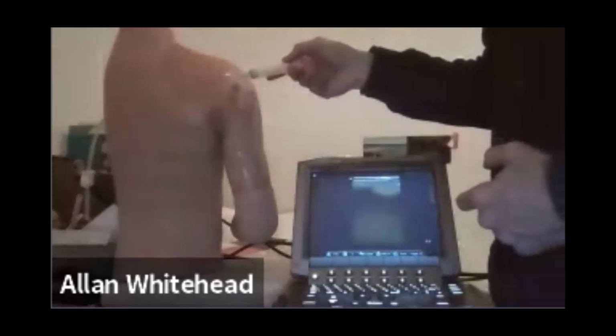Oh yeah, I've got fluid in there. Sorry, I don't want to suck all the fluid out, but there is fluid coming up into the syringe now. Sorry, the light's not very good. You'll just have to believe me.